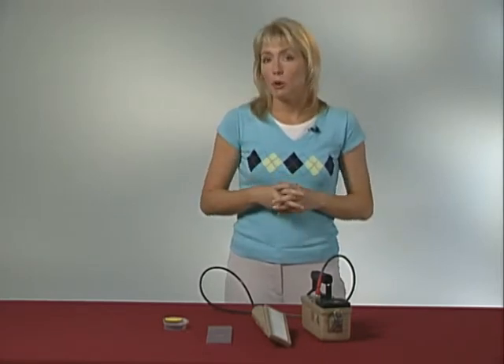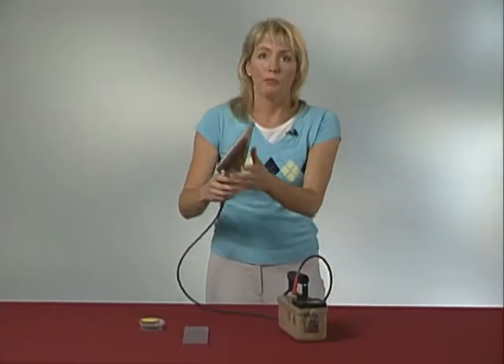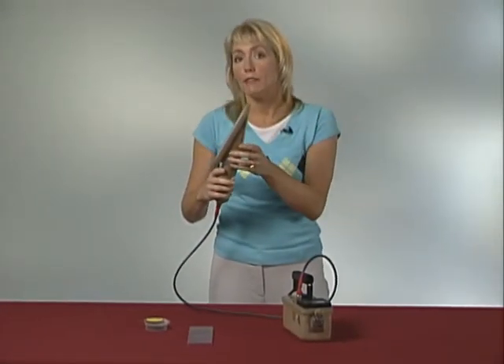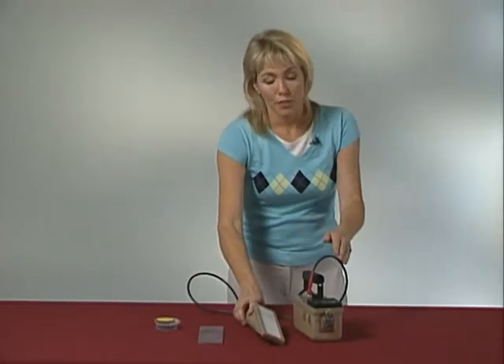Finally, if you are going to use a zinc sulfide alpha scintillator, you need to check for light leaks. With the audio on, point the face of the probe towards a source of light — an open window or an overhead light, for example. If there is a light leak, the meter will register many pulses. Then you need to locate the hole in the window and cover it with paint. In a pinch, a tiny piece of black electrical tape can be used.